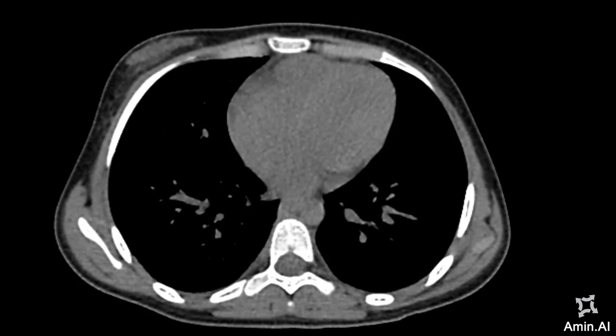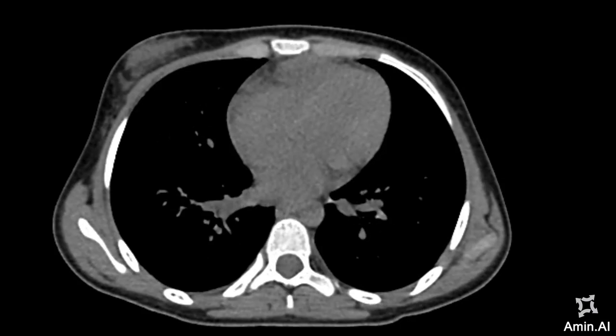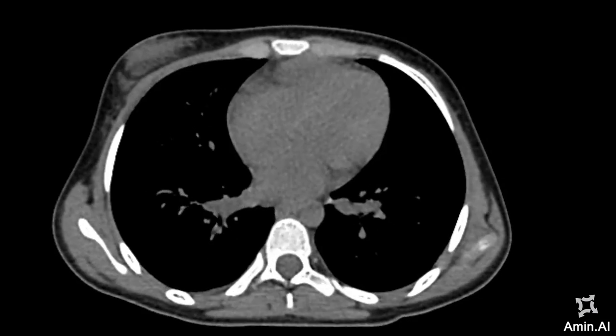This is a CT Abdomen case. The patient presents with significantly reduced haemoglobin. At the time of presentation the haemoglobin was approximately 4 and the patient presented with vomiting.